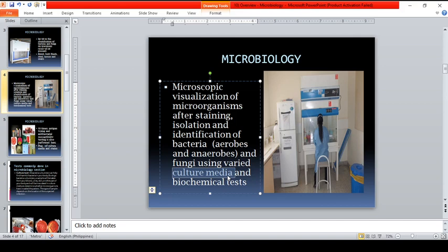That is to shorten the time for the bacteria to multiply. Okay? Kasi diba normally, the bacteria that are present in the sample, we don't see them. Okay? Because of their very small amount, and of course, their very small size. But when you use culture media kasi, sobrang napapabilis yung pagdami ng bacteria because you are giving them the nutrients that they need to multiply.